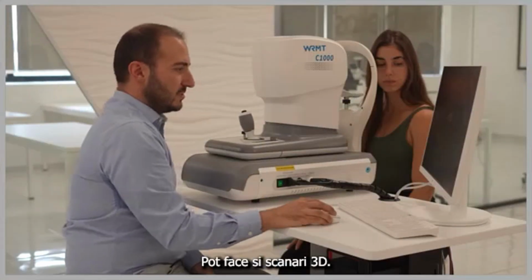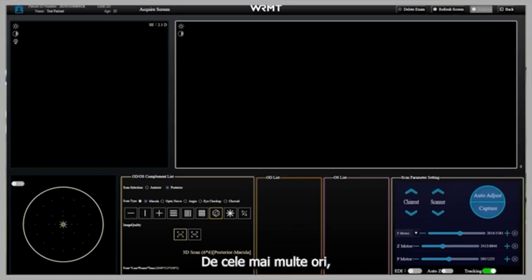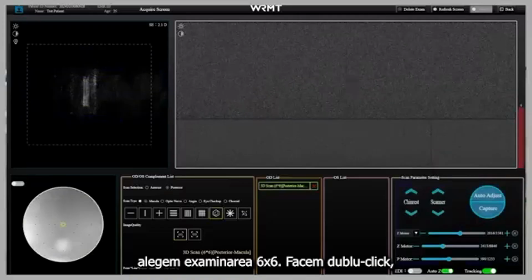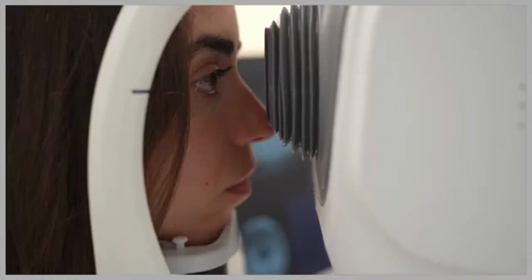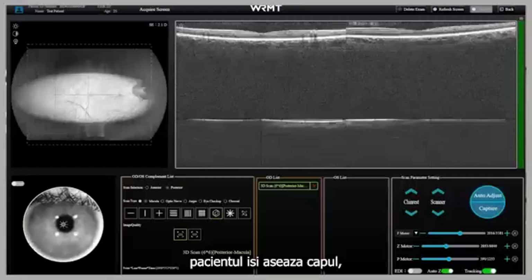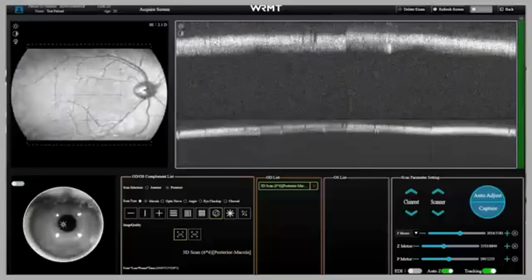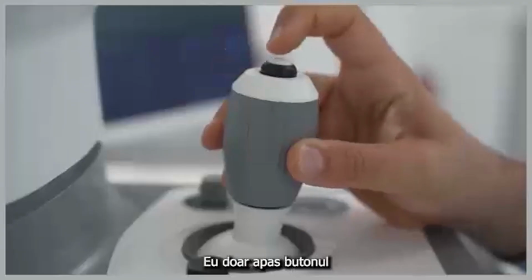I can also do the 3D scan. The 3D scan, there is the option of 6x6 and 9x9. So the typical OCT examination is the 6x6. I double click, the camera is initialized, the patient sits, the image automatically appears and I just press the button.